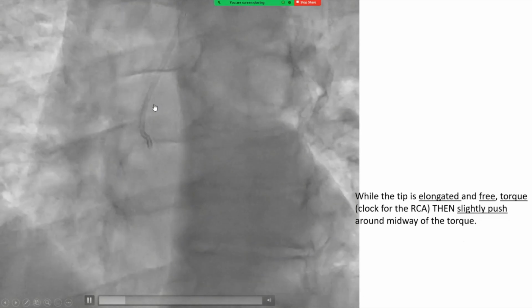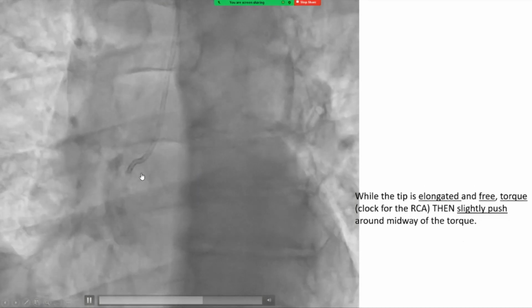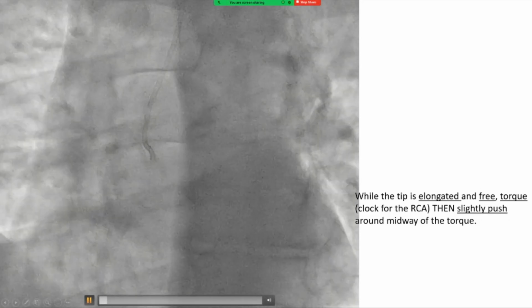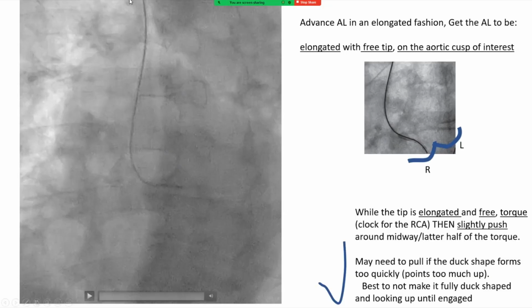While the tip is elongated and free, we clockwise torque, then slightly push around midway of the torque, and we successfully engaged. And it has the duck shape toward the end of the torque. Those maneuvers can be done while keeping the wire in to provide more torqueability and support, or after taking the wire out.